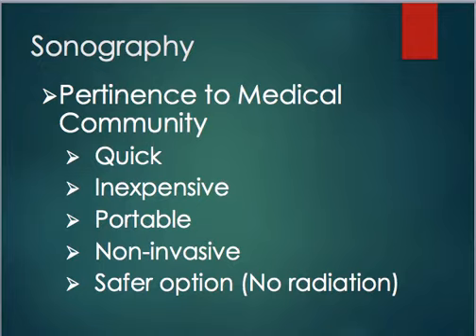So the pertinence to the medical community for sonography is it's quick, it's non-invasive, unless you're having a transvaginal or a rectal ultrasound. It's portable. We can take it to the patient's room. We can move around the hospital with it. It's relatively inexpensive. It is more expensive than general radiography, but it's still relatively cheap, especially when compared to things like surgery. And it's also a safer option because there is not radiation involved. Remember, ultrasound uses sound waves, so there is no radiation.